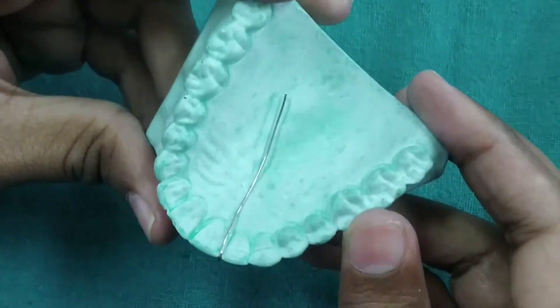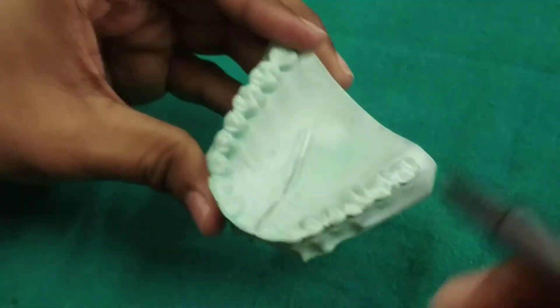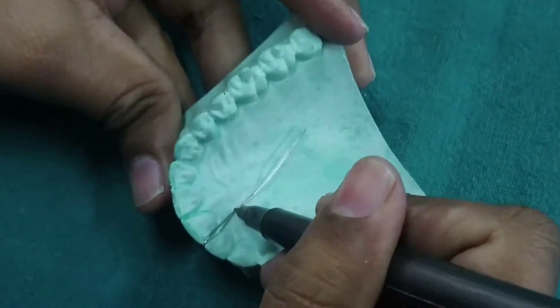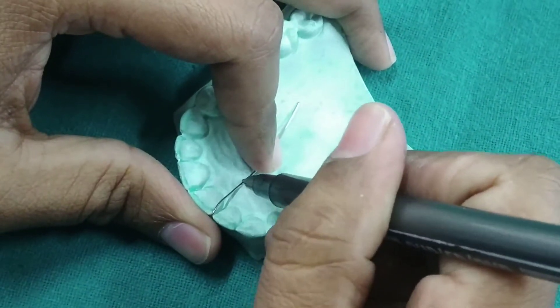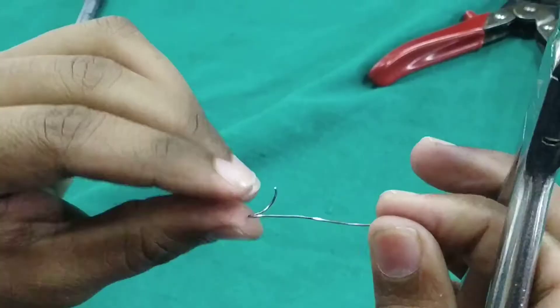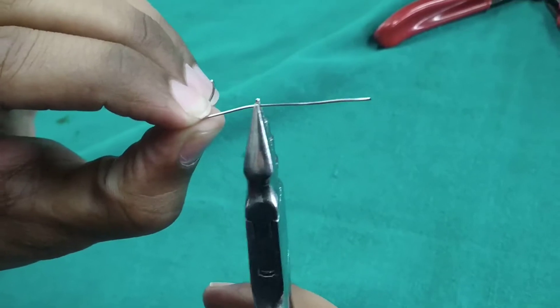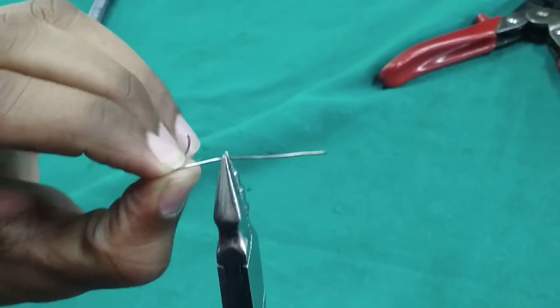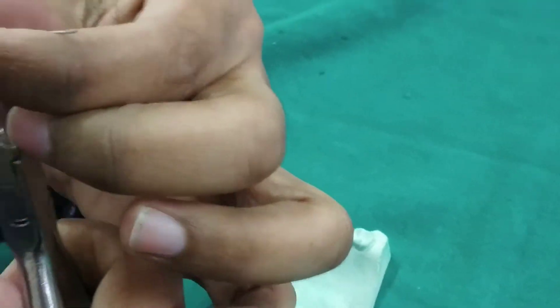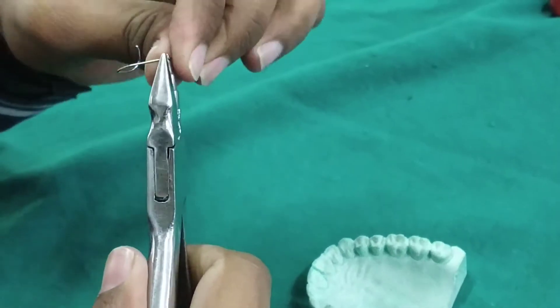Now the wire has been adapted to the palatal surface. A mark has been given where the helix is to be made. The helix is made of 3 mm diameter with the active arm towards the tissue surface.